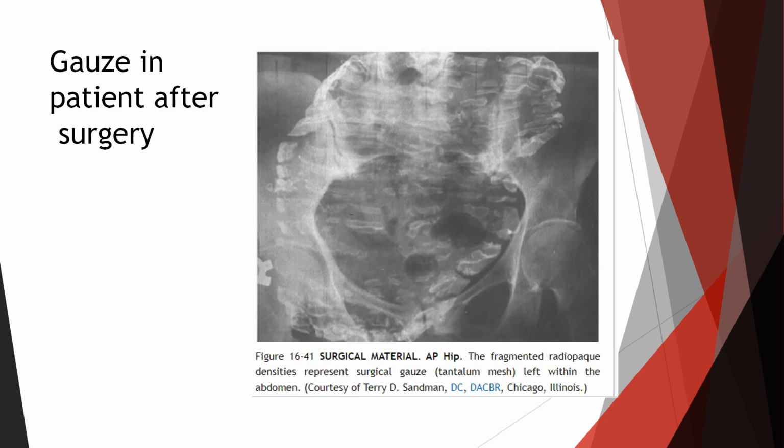This is gauze that's left in the patient after surgery, okay? The fragmented radiopaque densities represent the surgical gauze right here. So this is an object artifact.